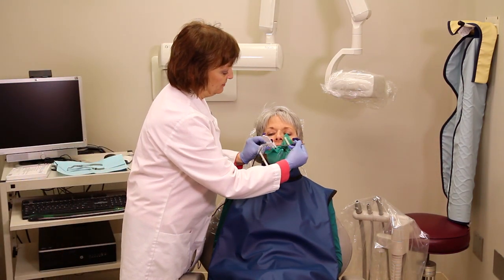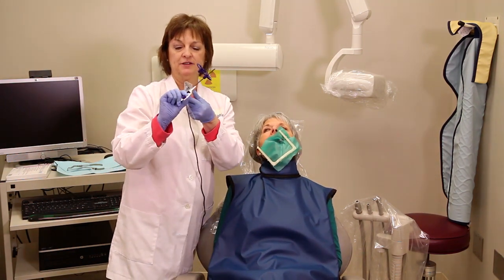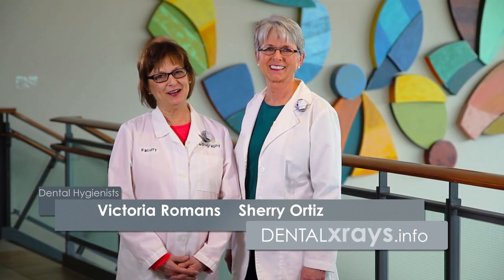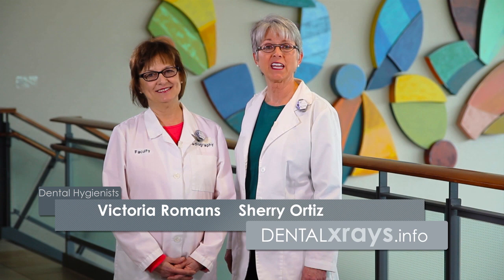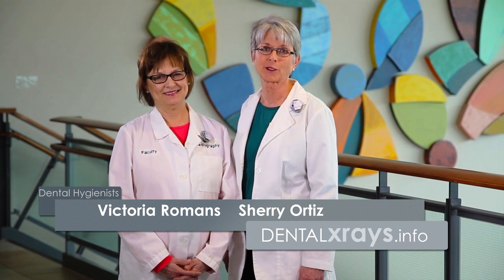When you take it out, this is how it was positioned, if you want to see right behind everything. We hope that this demonstration did help you today. And if you have any further questions, visit our website dentalxrays.info and click on Ask the Experts.